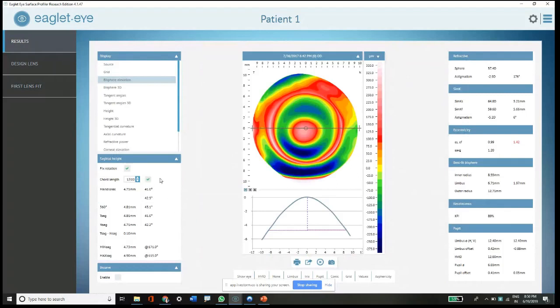That, along with some of these other maps, I'll show you very quickly that there are. I showed earlier there was a tangent map, but there's also quad maps and other maps that can be used to send to your labs and consultants. And I'll just real quickly say one more thing about the labs and manufacturers we work with.